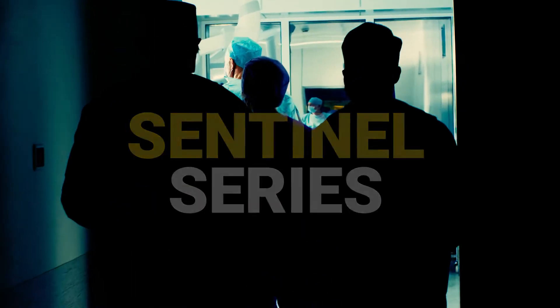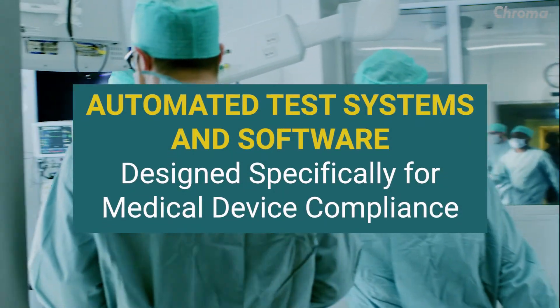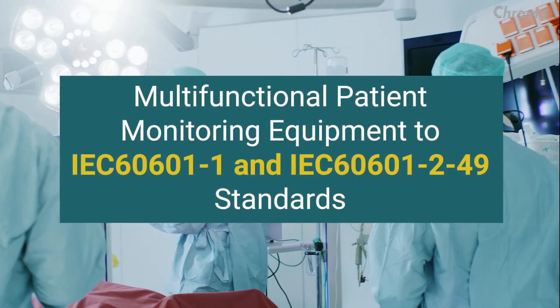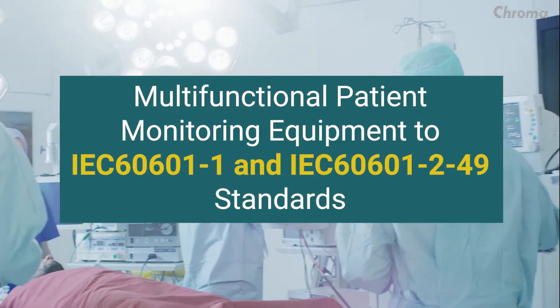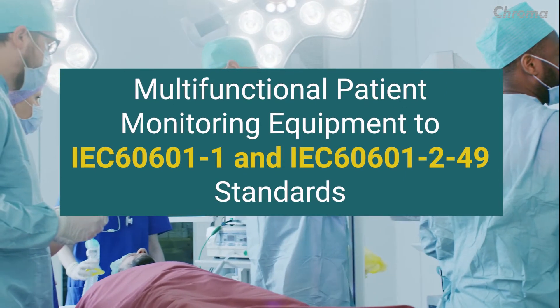Chroma Sentinel systems are automated test systems with software designed specifically for medical device compliance testing of multifunctional patient monitoring equipment to IEC 60601-1 and IEC 60601-2-49 standards.